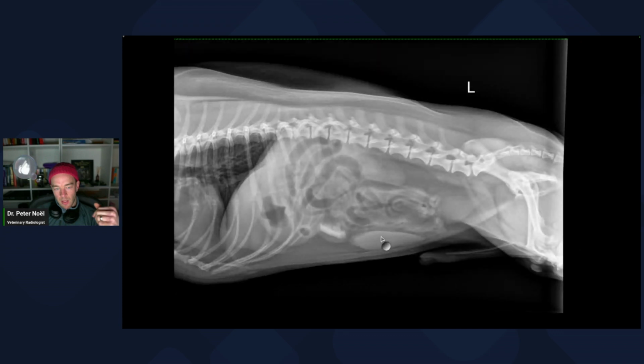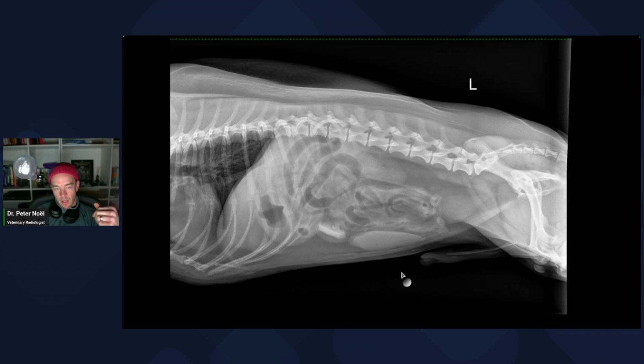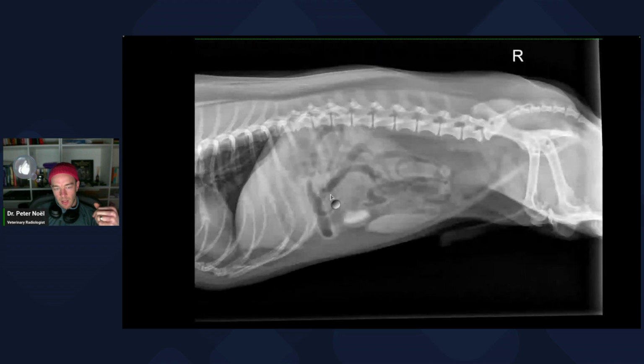But this doc wants to know, do you have to cut the dog? That's the big question, right? So just because you saw the foreign body, I think the loop that the foreign body's in is a little bit distended, but man, all these other loops are not that distended. Even though there are two populations, like this one's bigger than some of the empty ones, these aren't that big. I mean, it's not huge.